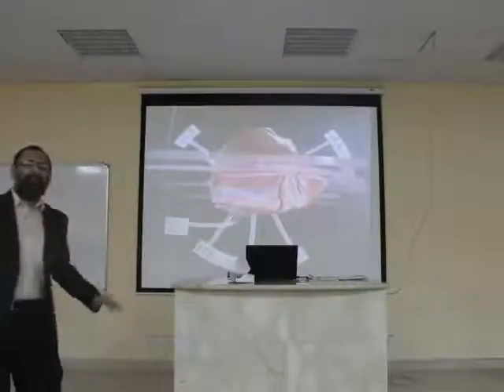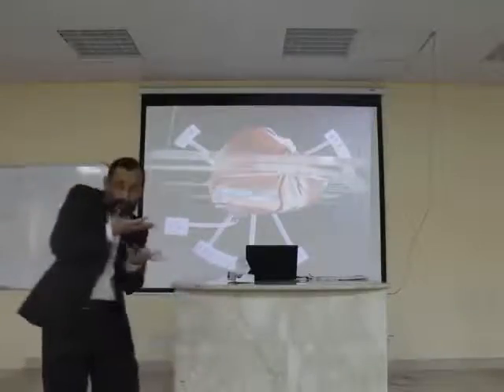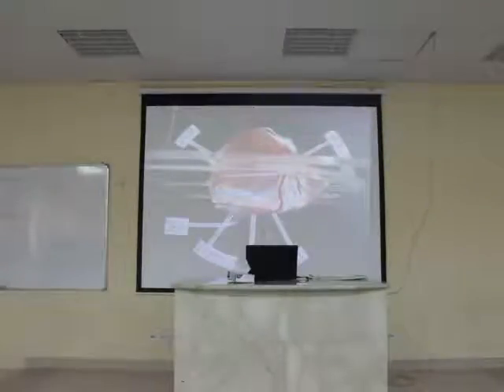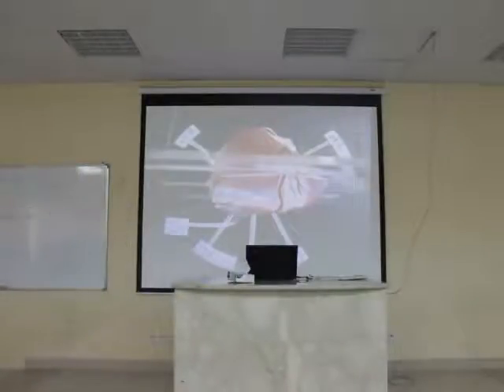But you are not satisfied so far because you haven't seen the inferior surface of the heart. The heart has an inferior surface which is resting on the diaphragm. You know that, and you have to cover the inferior surface also. 3 leads are viewing from the inferior surface and recording the electrical activity from there. Look at these 3 leads: lead 2, lead 3 and AVF.